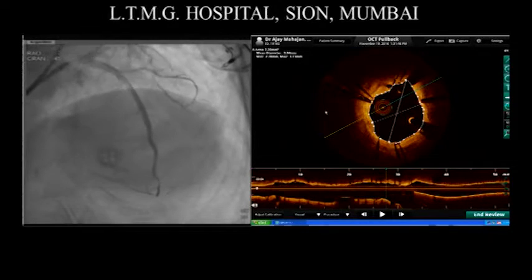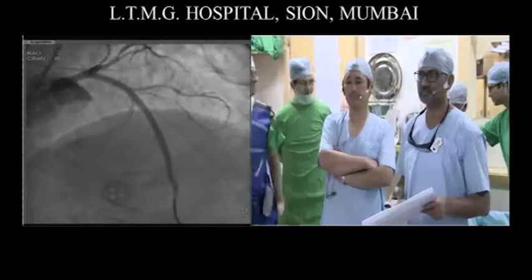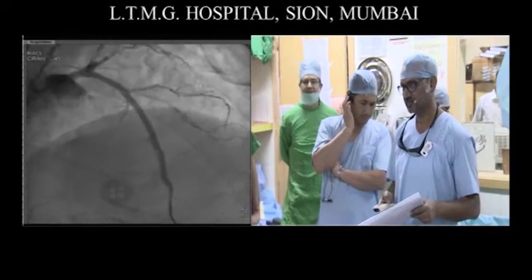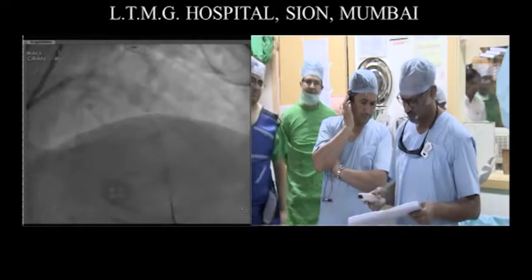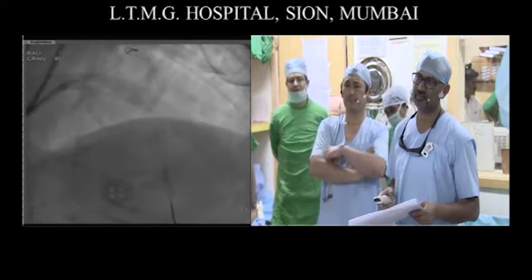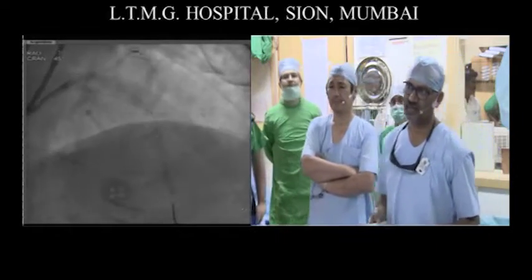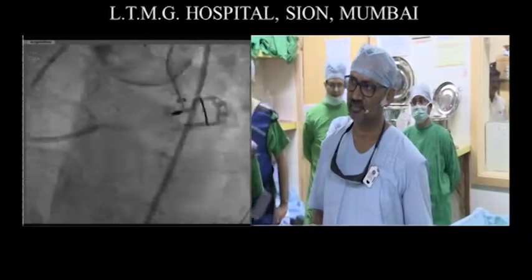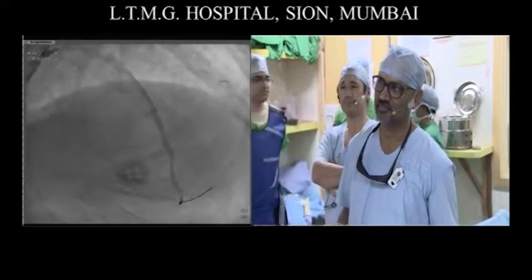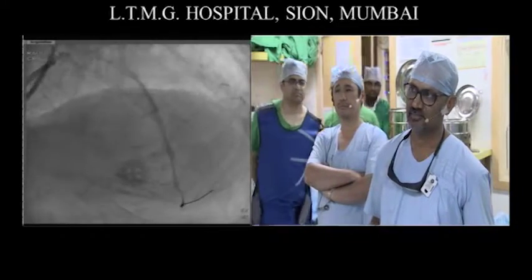Any question from the panel? First of all, is it possible that we could see the most proximal part of the stent? Ajay, can you show the OCT of proximal left main, proximal LAD and left main? Because I think that maybe there is some malposition in the ostial part of the stent in left main. We could see it only for a short moment.